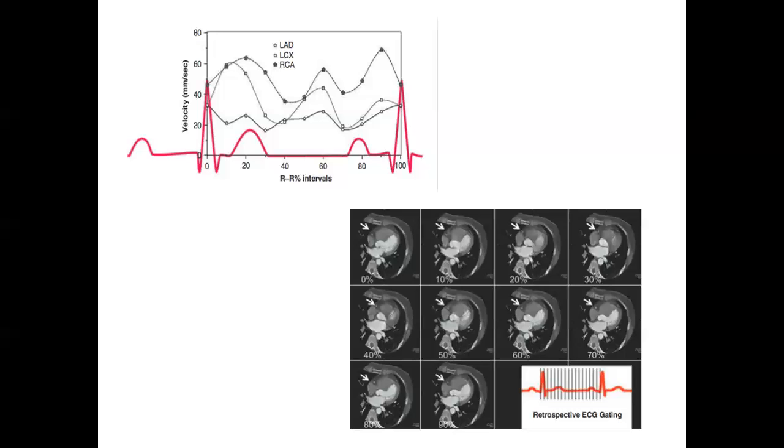And I think we'll get to what you're talking about. There are different scanning protocols that vary with how much of the RR interval we take. So we'll talk about that. But just understand, CT is gated, and the reason we are doing gating is to freeze cardiac motion so we can stitch the images together. Without it, we wouldn't know what was acquired at what time, and you wouldn't be able to stitch them together.